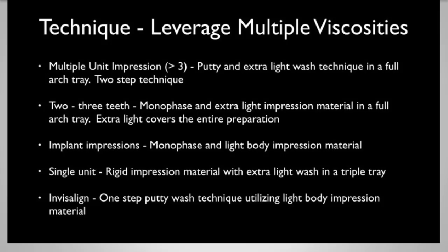For implant impressions, I utilize a monophase material with a light body impression material. With implant impressions around implant posts, we want some rigidity. We're not generally going into a really, really deep sulcus. We want light body impression material to go around the fixture connection point, but it's not going into the traditional sulcus like we would have with a crown prep.